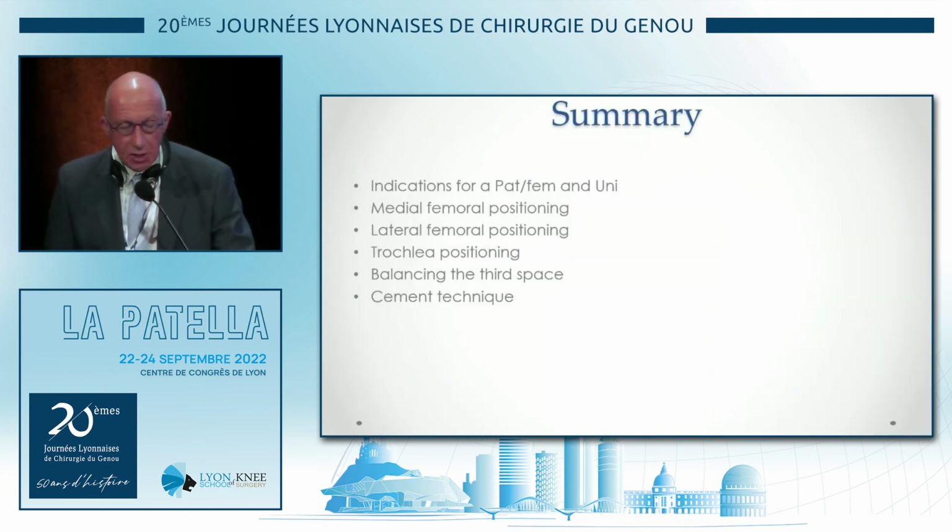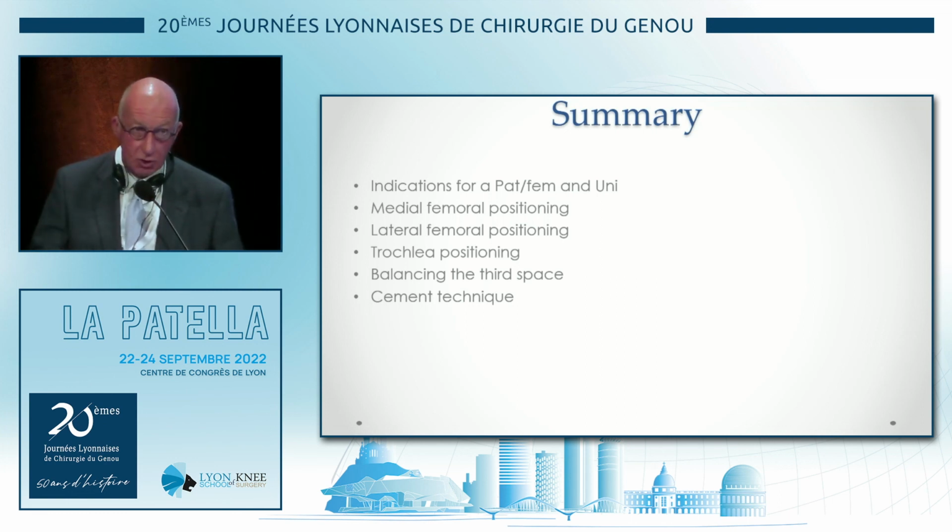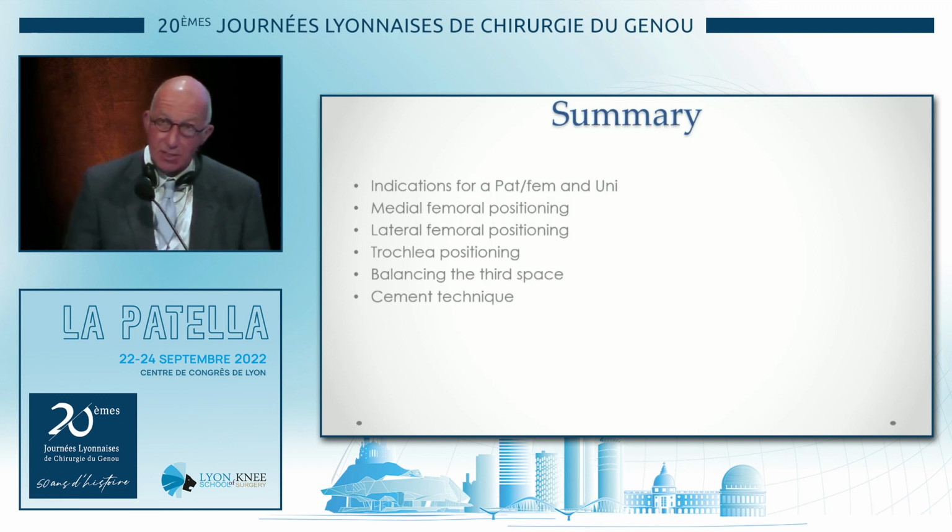And so, in summary of these 6 points, the indications we've talked about, be aware that the two unis are completely different in their orientation. Be aware of the trochlear position. This is not a total knee. And you balance the third space and make sure you cement it correctly.